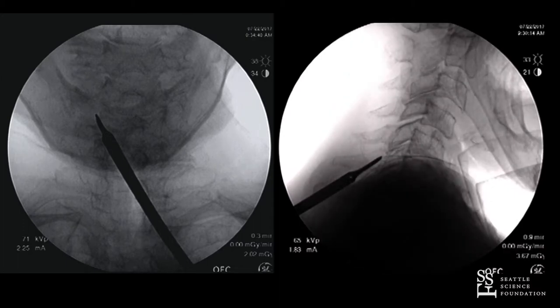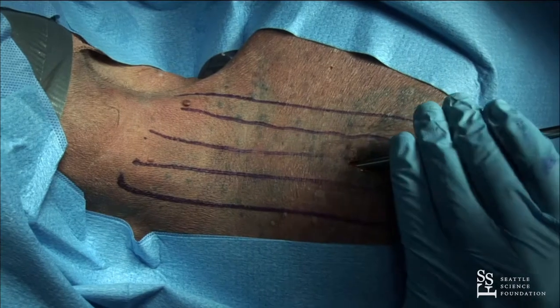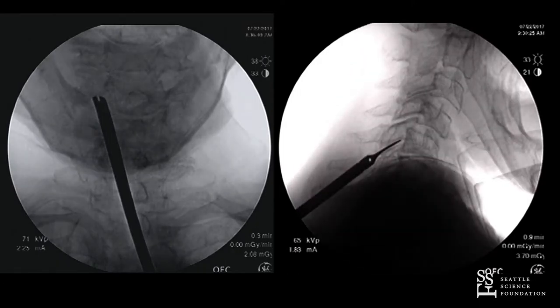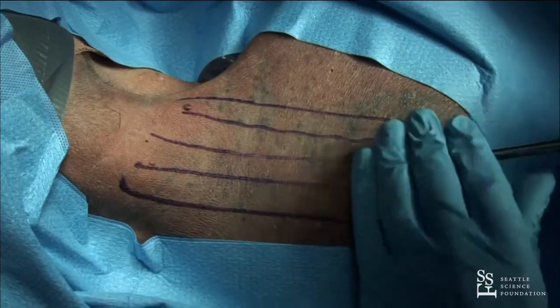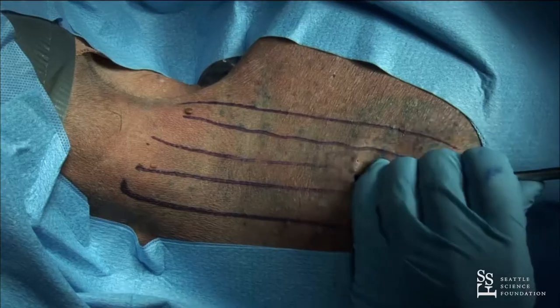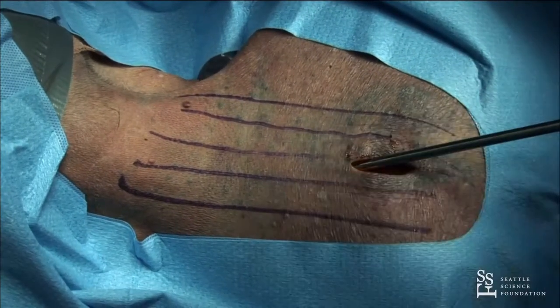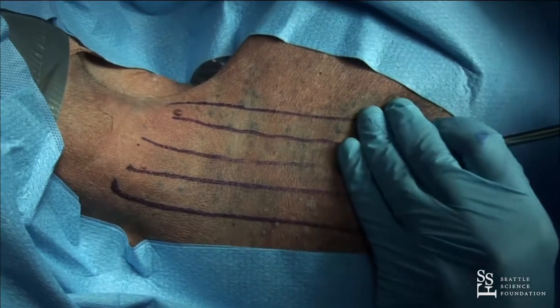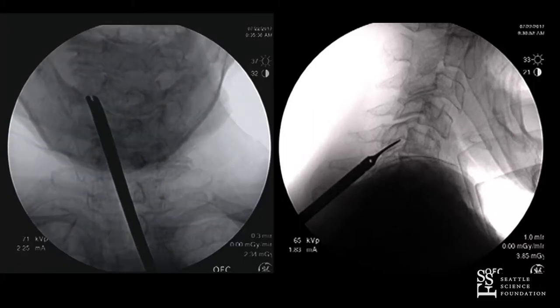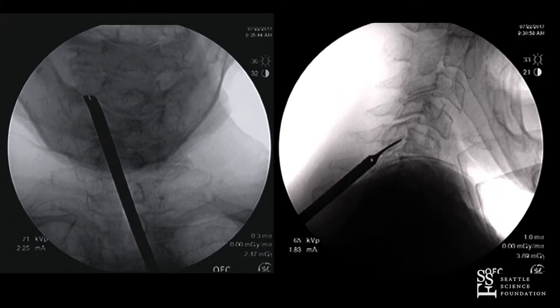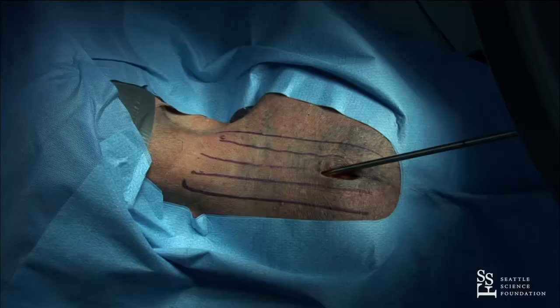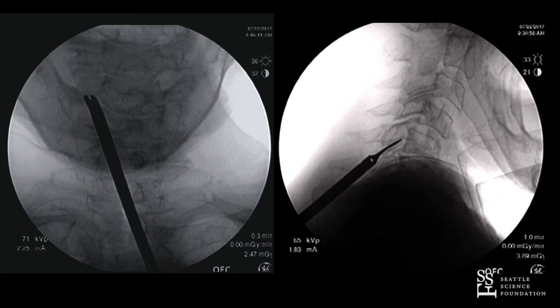Once it goes in — I'm a little medial there, so instead of pulling it out, I just kind of shim it over. It'll move in the joint. I'll try to come a little more lateral. It's probably acceptable. You can see how this acts as a spatula. I don't have a perfect trajectory in the facet, but the metal front end of that thing is pliable enough — it'll follow the facet border, which is generally pretty stiff. Once that's in position, that's your post. You can't advance it any further because it's hitting the pedicle, and it's confined by the boundaries of the facet.